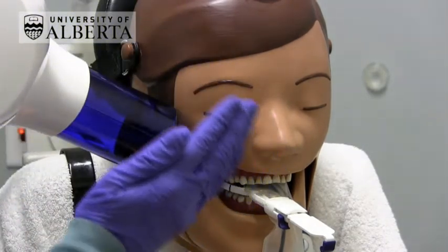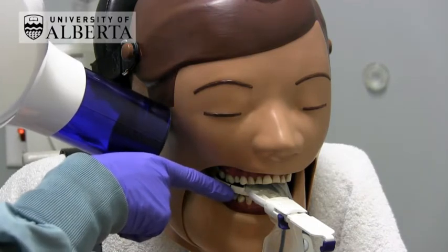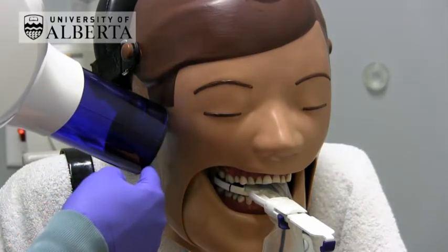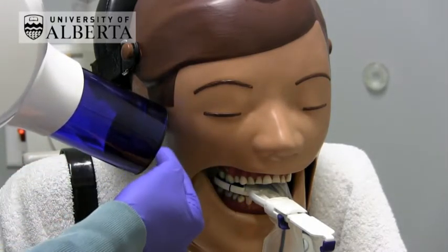To decide how far anteriorly or posteriorly to place the tube head, put your finger on the blue line of the bite block and gently position the aperture of the BID so that the blue line is just within the edge of the aperture.